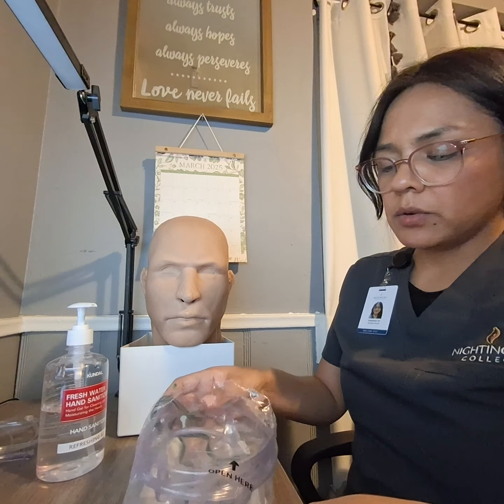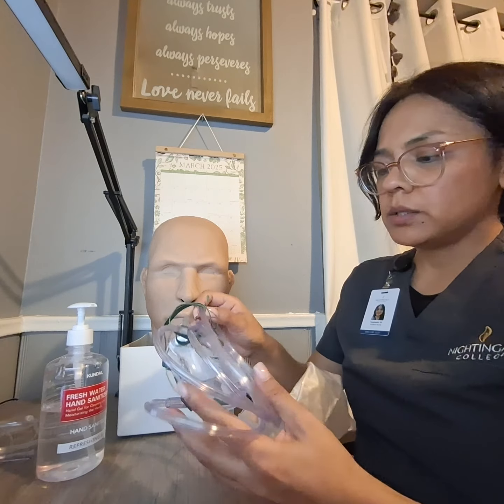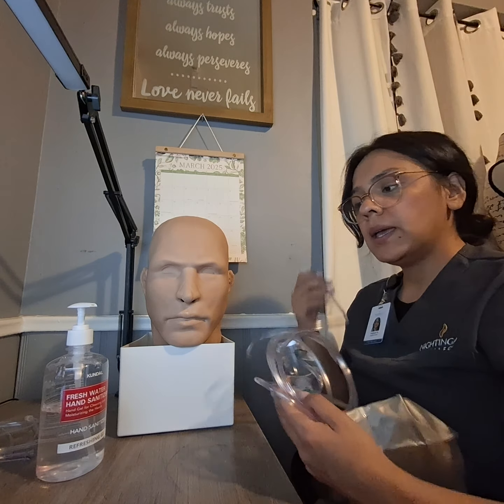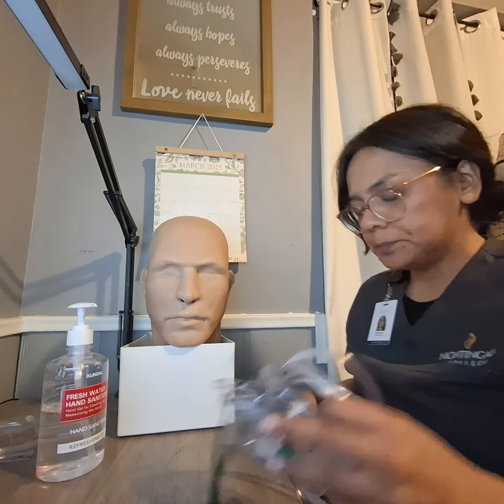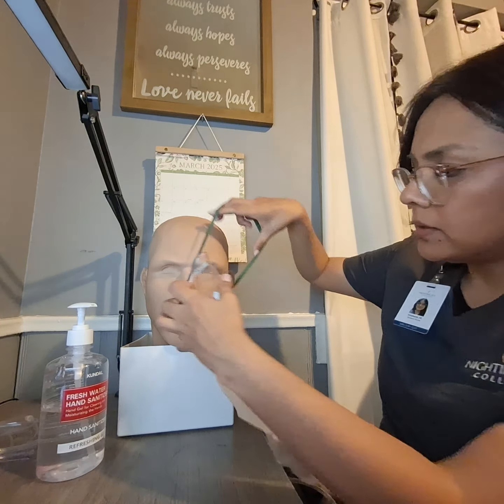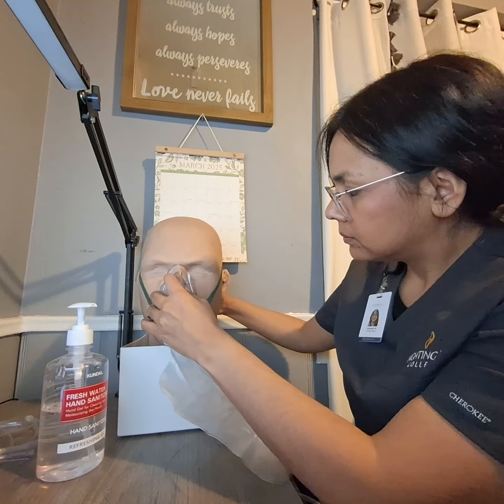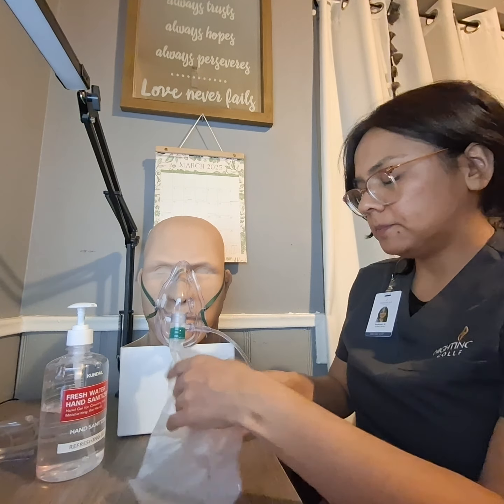I will take my non-rebreather mask. I will take the tubing from the non-rebreather mask, connect it to the wall here to the oxygen flow meter. That rate should be around 12 to 15 liters per minute. Per the doctor's order, we're going to go ahead and set it to 13 liters per minute. I will go ahead and apply the mask over the nose and wrap around the patient's head. At this point, we should start hearing some oxygen flowing here.